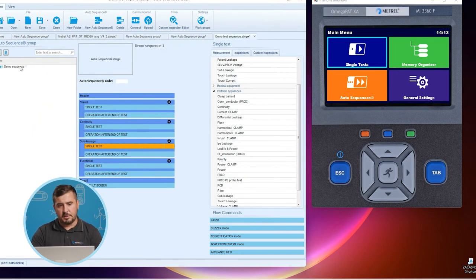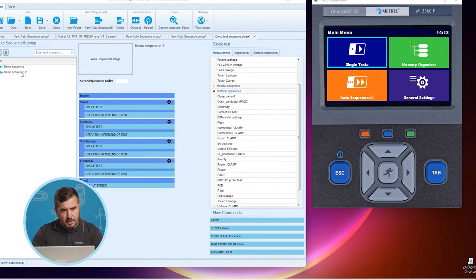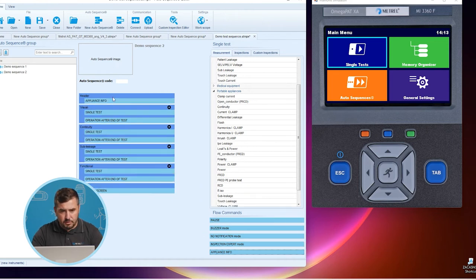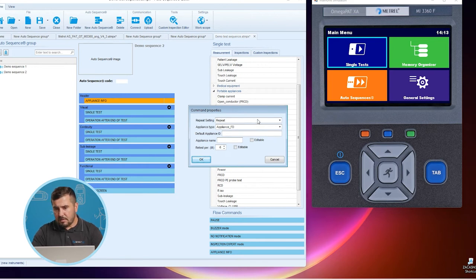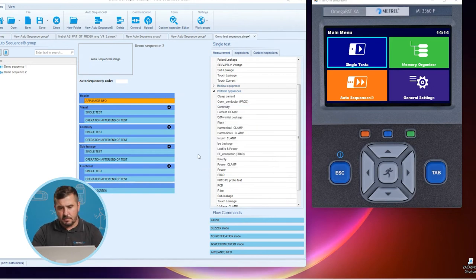Such an auto sequence can already be uploaded to our simulator or to our test instrument and we can proceed testing. I would also like to show some different possibilities. The second sequence will be a copy of the first, renamed to Auto Sequence 2. For this one we will install an Appliance Info flow command in the header. For this first appliance info flow command we will use the default settings, meaning the instrument will ask only about the appliance ID during execution of the auto sequence.